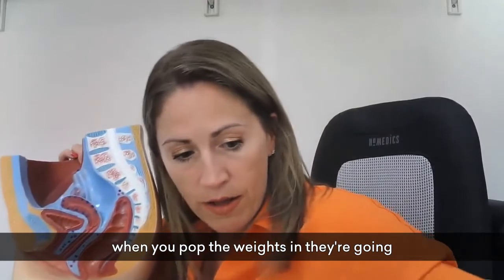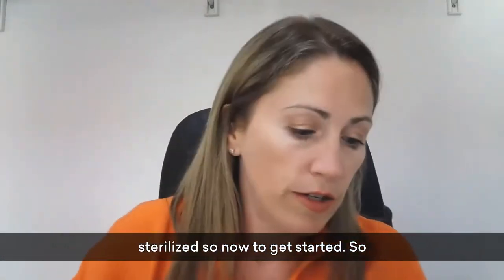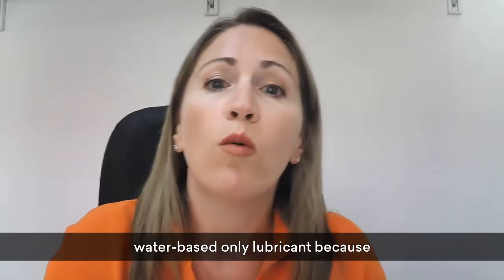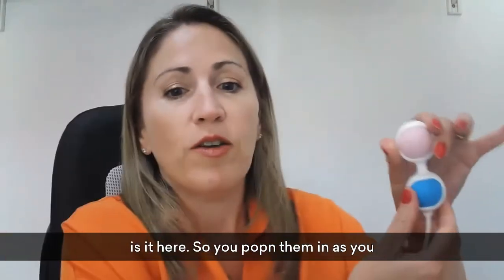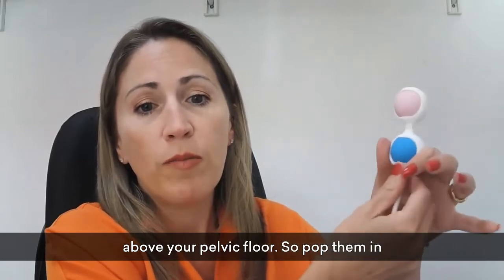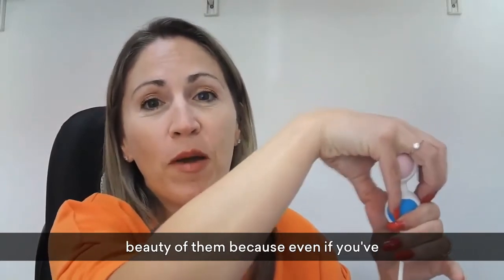When you pop the weights in, they're going to sit just on top of the pelvic floor. Now that you've sterilized them, you can choose to use a lubricant, just water, or nothing — it's totally up to you. Most women prefer a lubricant, but if you do, use a water-based lubricant only, as any other type can damage your weights. You insert them as you would a tampon — they can't go too far, can't get lost, and will rest just above your pelvic floor.